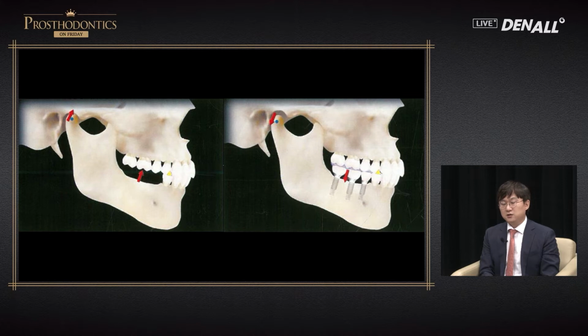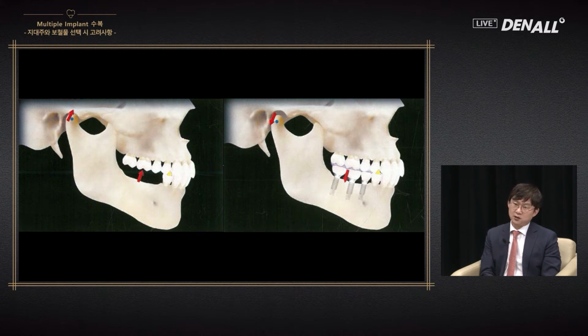For a single case, I use the approach previously mentioned, implant level, screw type. Aesthetically, we can change the profile with the prosthesis. In a multiple teeth missing case in the posterior region, I use a different approach. There is the implant sinking problem, and the TMJ can be displaced when teeth are missing. When the prosthesis is delivered, the occlusion can be changed.